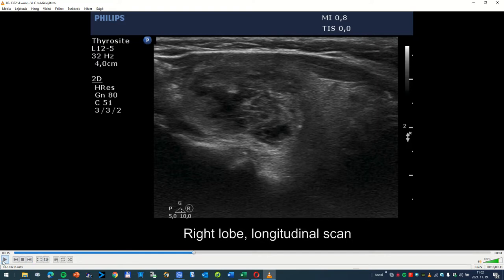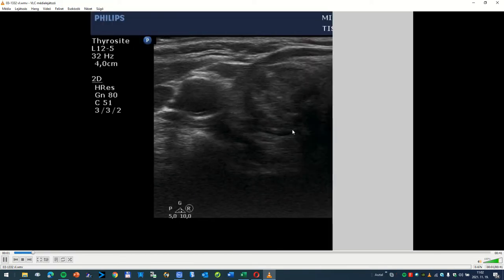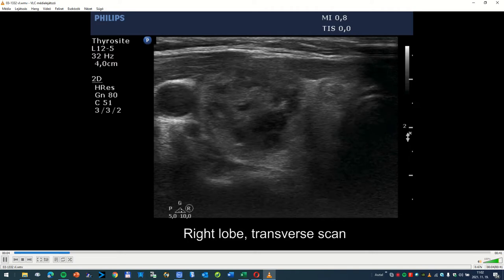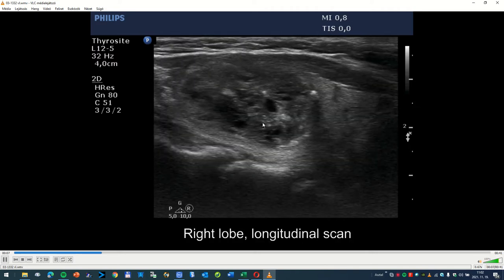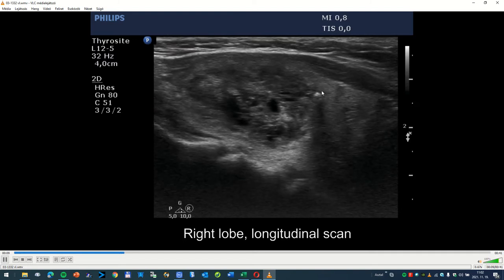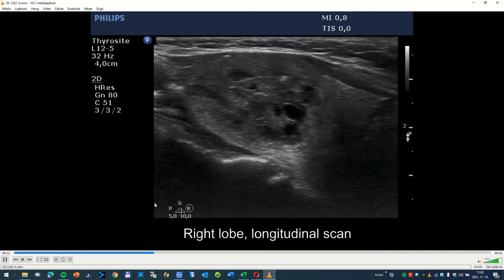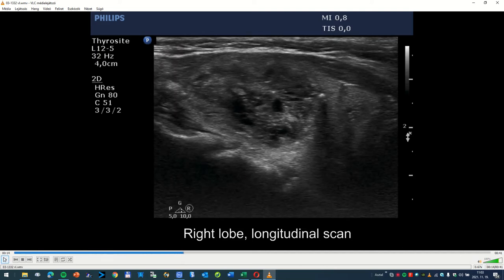I restart the video from the start. So here, there, and here in the dorsal part. These three or four granules are much larger and much brighter compared to, for example, these smaller granules.